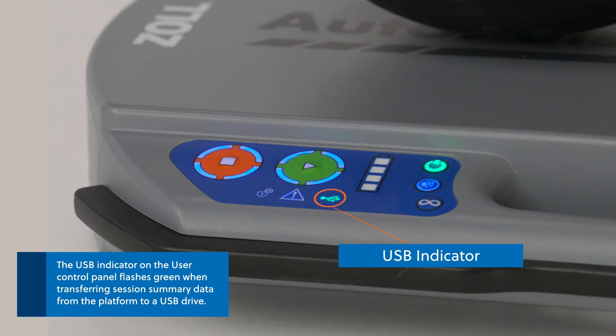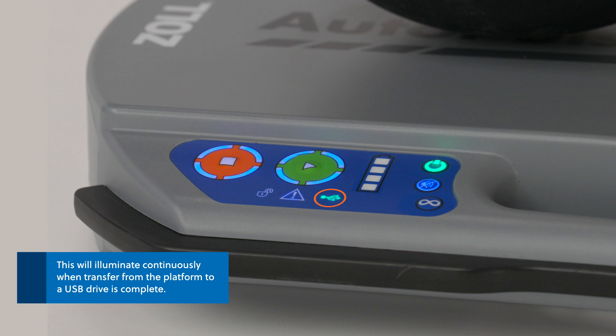The USB indicator on the user control panel flashes green when transferring session summary data from the platform to a USB drive. It will illuminate continuously when the transfer from the platform to a USB drive is complete.